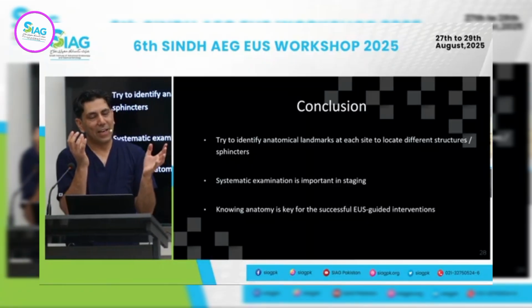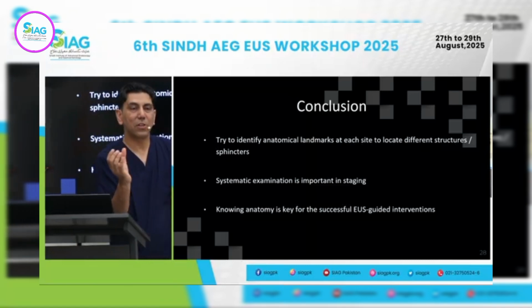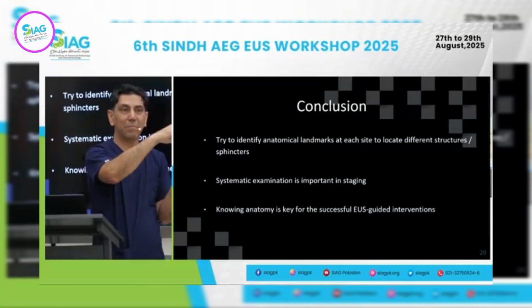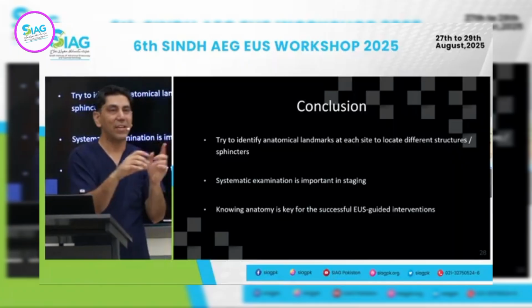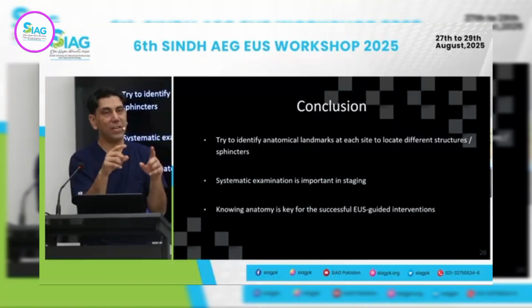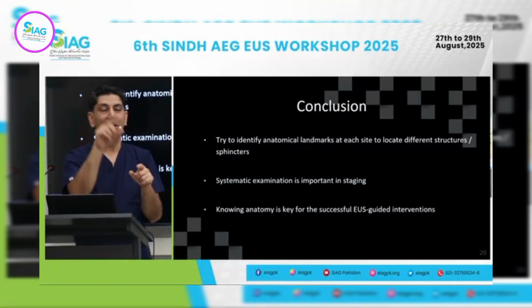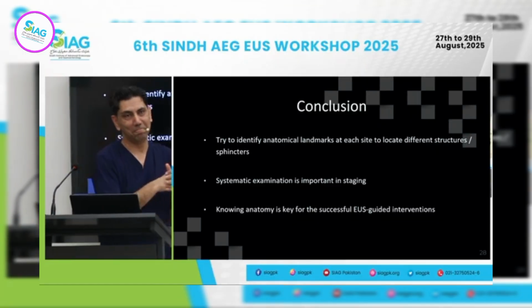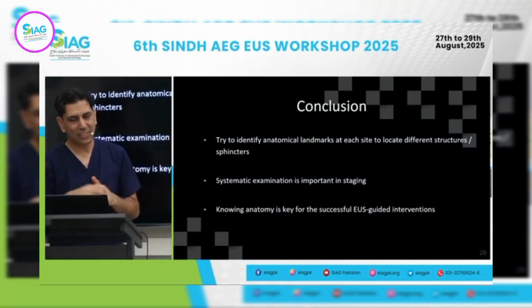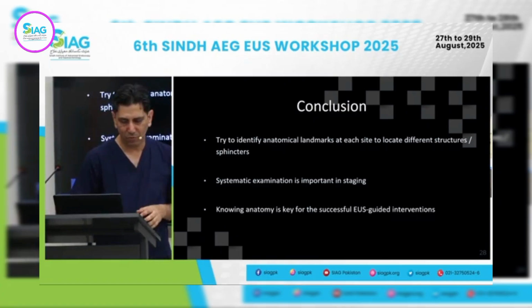And then the urinary bladder, which may look like a kidney shape, but a kidney which doesn't seem to end one way or the other. And in the male patient, the prostate, which appears like a kidney with a cortex and medulla, when it does not actually have a cortex and medulla. Okay, so that's a very brief way of doing it.